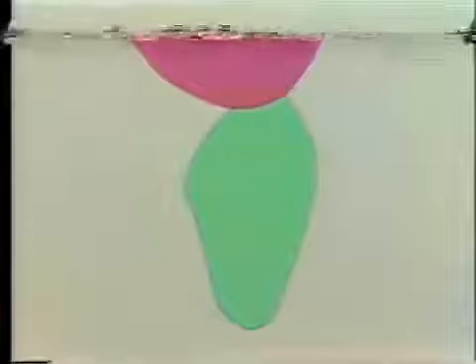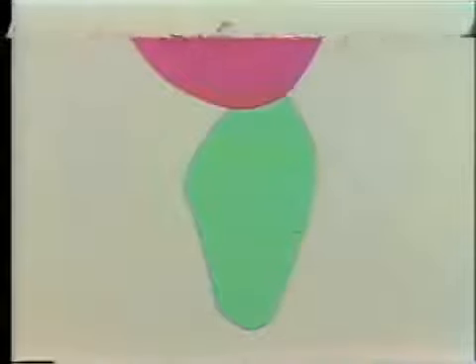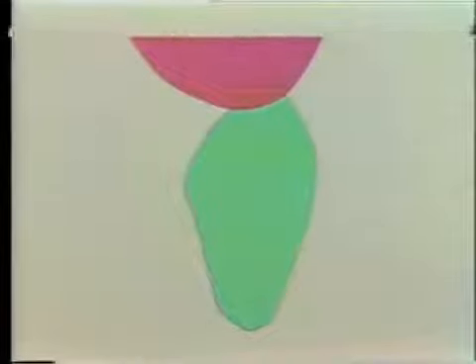And recognizing in this diagram that the right-hand side of the screen is the labial and the left-hand side is the lingual surface, you can see that the Pontic contacts the alveolus from the labial contact just back lingually to the crest of the ridge, and then the Pontic on the lingual surface shoots away clear from that, opening up the lingual embrasure. This results in a minimum contact of Pontic with the mucosa covering the alveolus, and yet sufficient contact there to give good aesthetics in the finished bridge case.